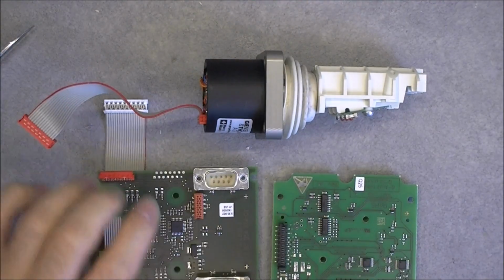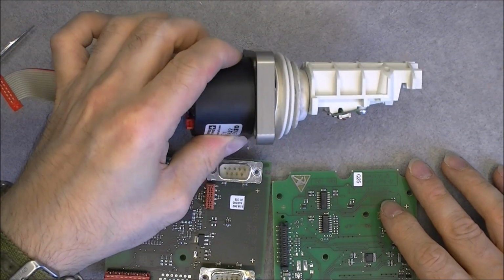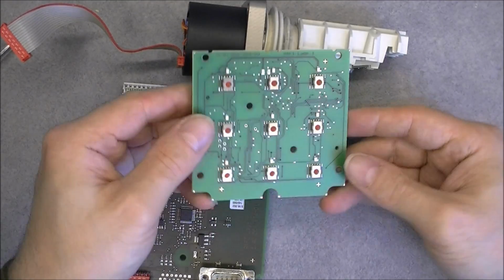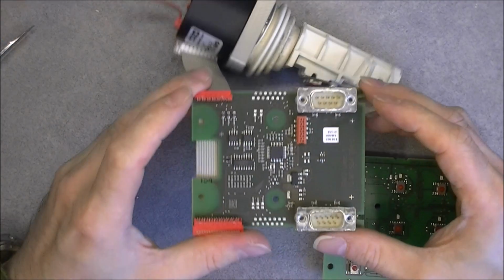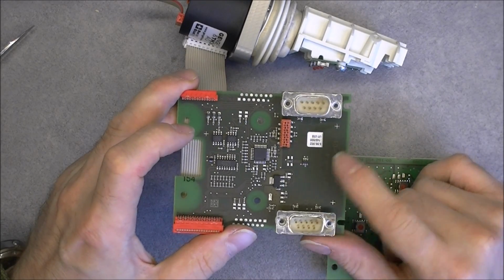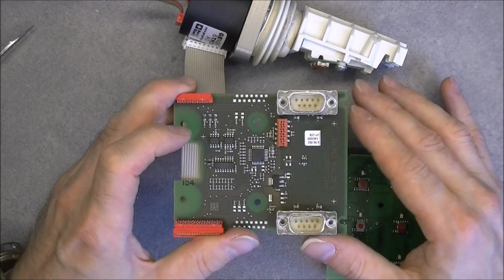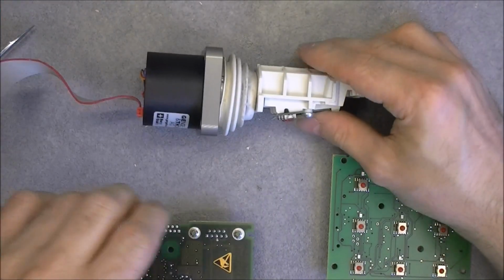The other ones, little spoiler here. Inside the other ones you have the same kind of joystick unit. Maybe not exactly identical, but the same shape and manufacturer. The other keyboards are more or less exactly this PCB, but we have different versions of this PCB. Some of the other boxes include a DC to DC power converter, and some of the most complicated ones have what seems to be a microprocessor with a firmware EEPROM or something like this. So we will check this in the upcoming videos.